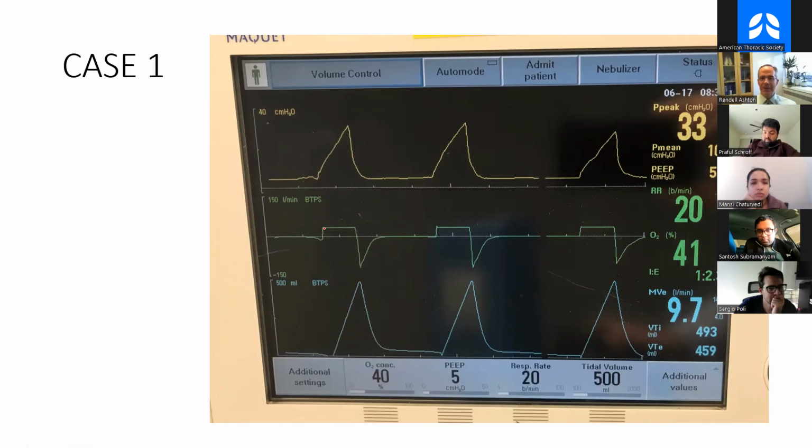Everybody sees this straight line, right? My pen's working here. See how straight that is? Straighter than the line I drew. If you see that straight across line, that means there's a constant flow. If flow is locked, so is volume. Remember, they're on the same side of the equation, but pressure would be the dependent variable. But you gotta be careful because sometimes the flow isn't locked at a particular value.